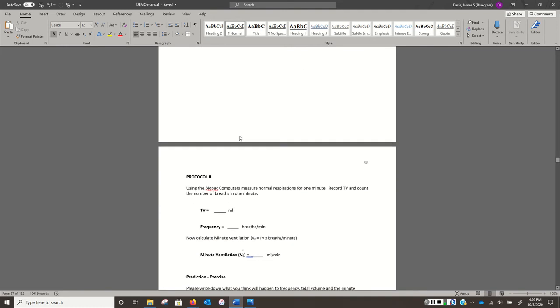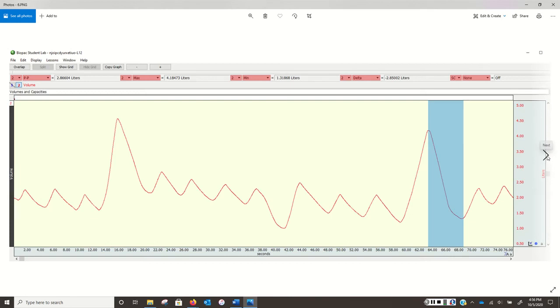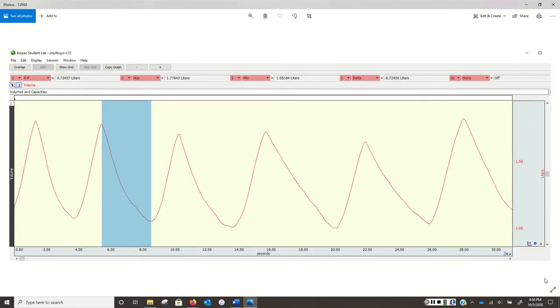Now, protocol 2 is going to be looking at the effects of exercise on breathing. I'm going to do another readout and get my tidal volume and my frequency. We're going to use those to calculate minute ventilation. Minute ventilation, remember, is tidal volume times breathing rate or frequency. So here is the readout pre-exercise. And pre-exercise, I did this for 30 seconds. So we want this for a minute.